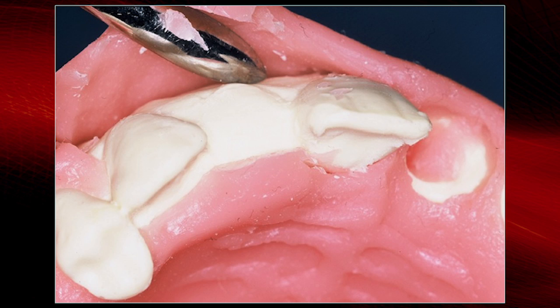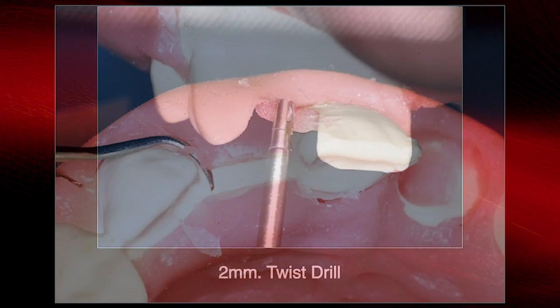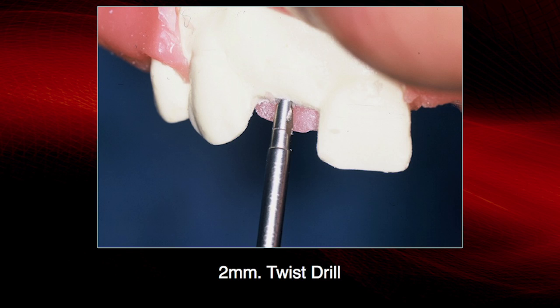So now you can see where the bone is, your buccal lingual width, and you want to be parallel to these adjacent roots when you enter into it. Now, if you use that little guide that you made on the model, you went in maybe 4 or 5 millimeters, you could see the mark. If you're not happy, that's the time you can make an adjustment. You want to root plane the adjacent teeth so we don't get any toxins, any deposit that's on the teeth into the osteotomy to help prevent a post-operative infection.